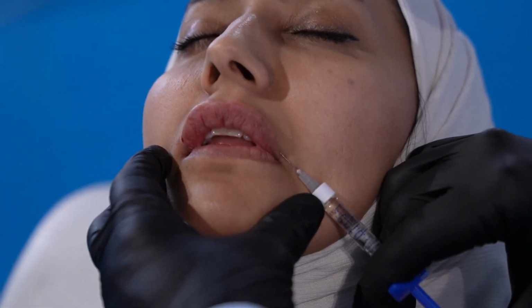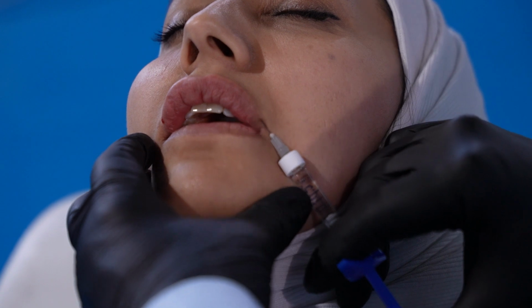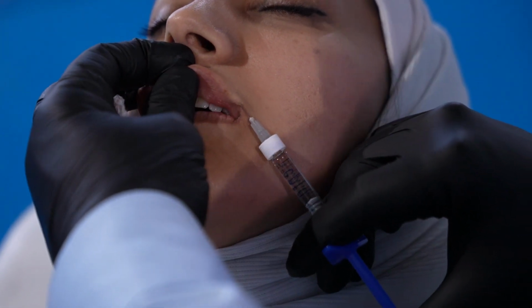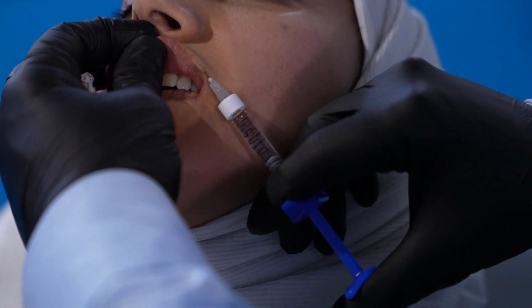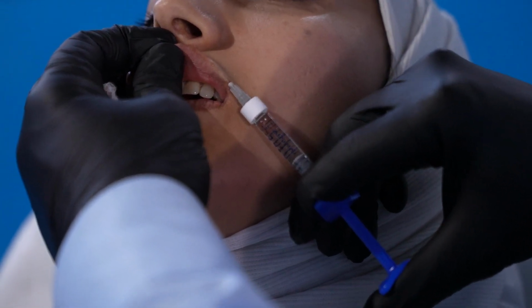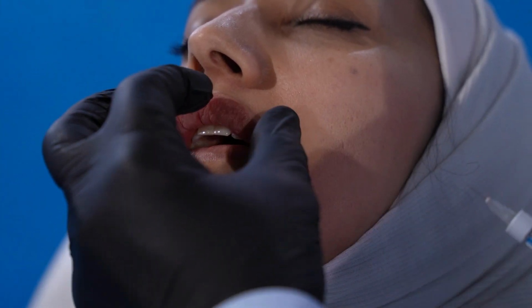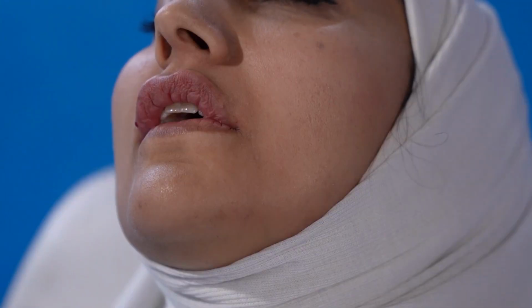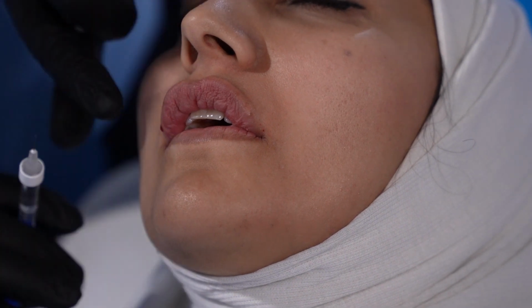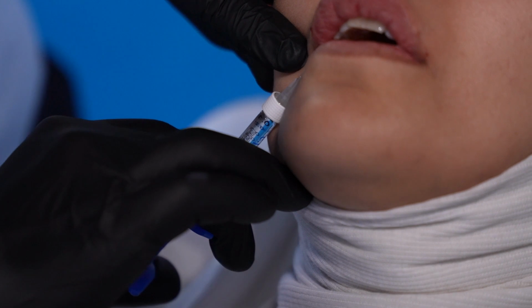The same thing from the commissure, a simple puncture and going through the vermilion border. And the same, now injecting from here.